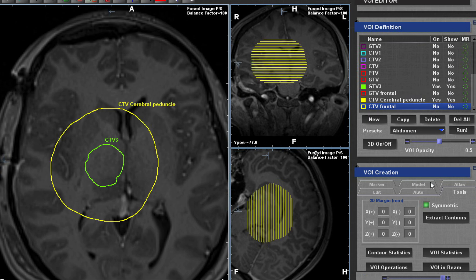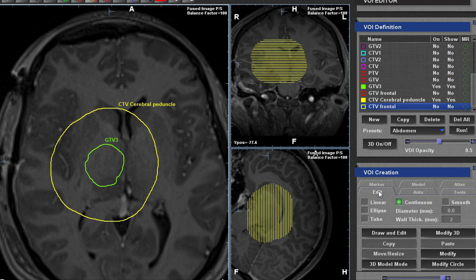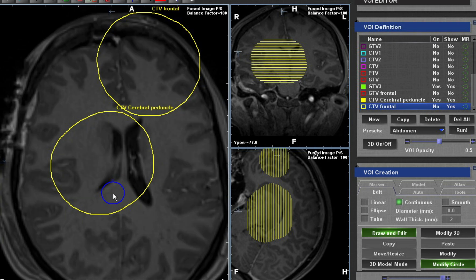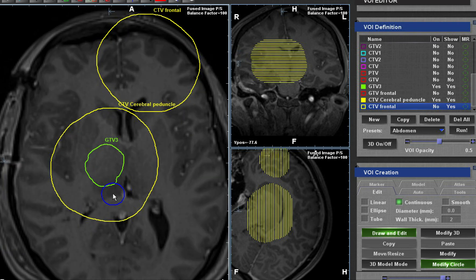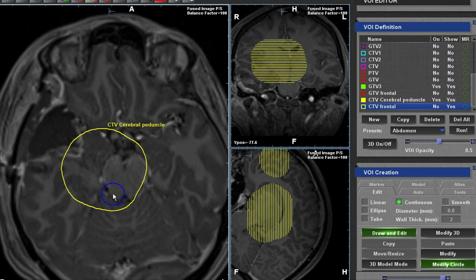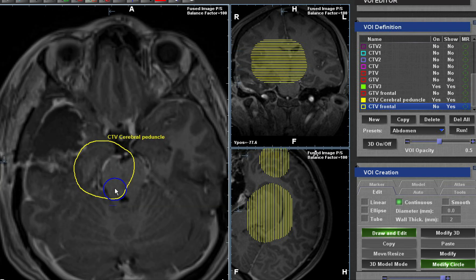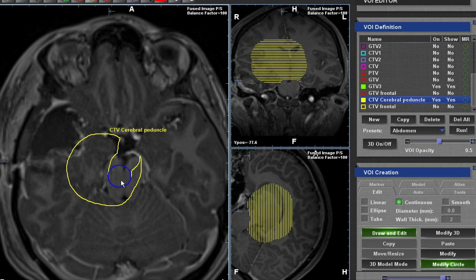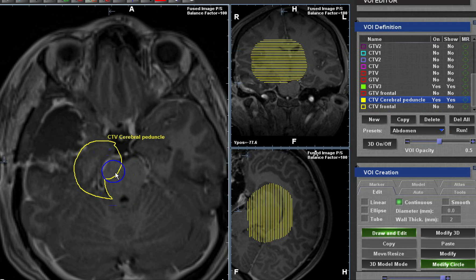When you apply your two-centimeter CTV and go through the trimming process, please do not trim at the level of the cerebral peduncle. It is a very common site of relapse and you may miss it if you just trim the brain stem as before. From now on, the cerebral peduncle must be included in your CTV.